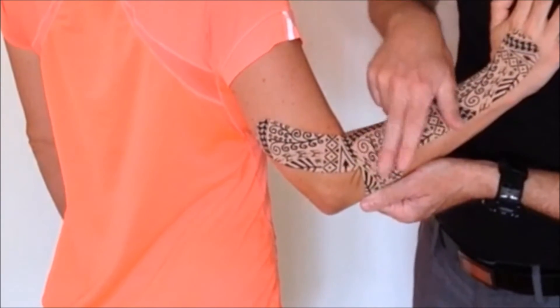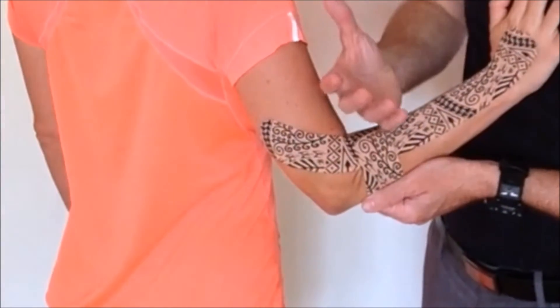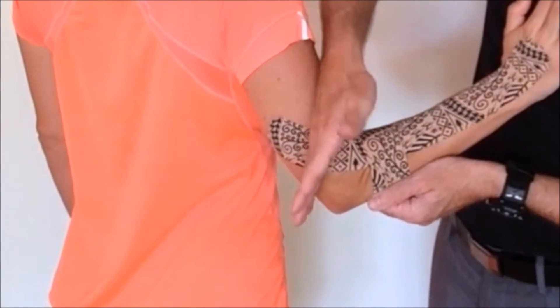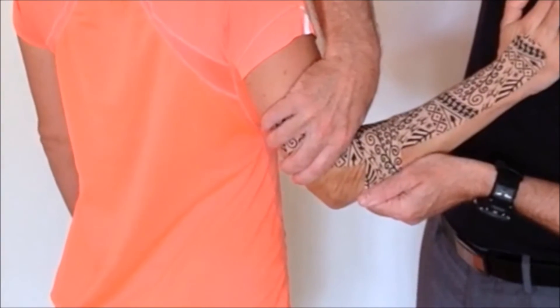Notice there are no convolutions in the tape. It's all boxing the soft tissue up first and then holding it in position using that strong recoil of the tape. If I wanted to increase it further, I could bring in another strip on this side and really box it all up around there.